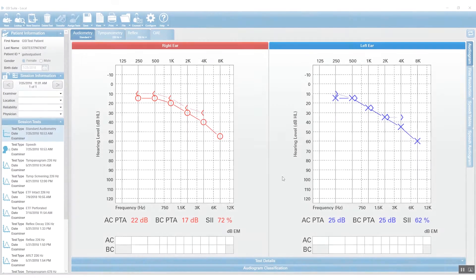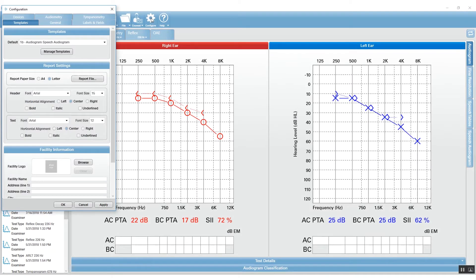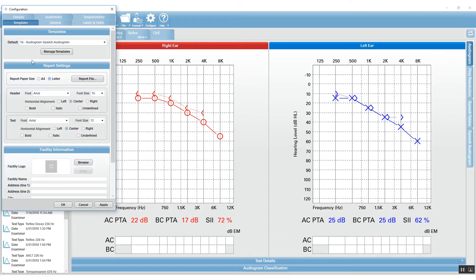To use the template editor and template manager, go to the configure icon where you'll see a tab called Templates. The templates tab works as follows: the top section is where you manage your customized templates. Grayson Stadler has several locked templates preloaded into the GSI Suite.